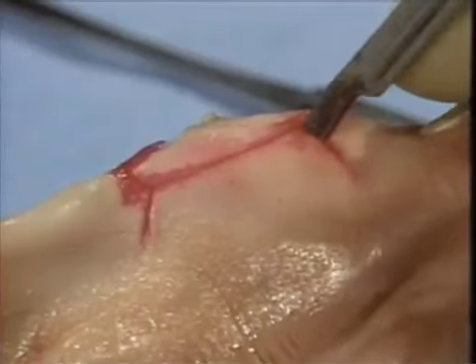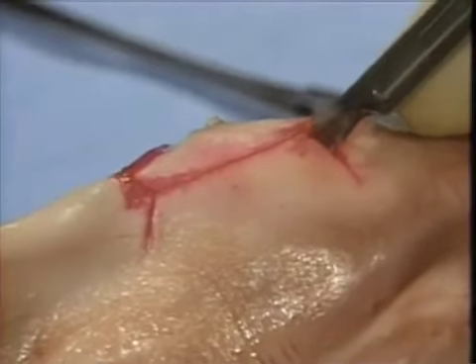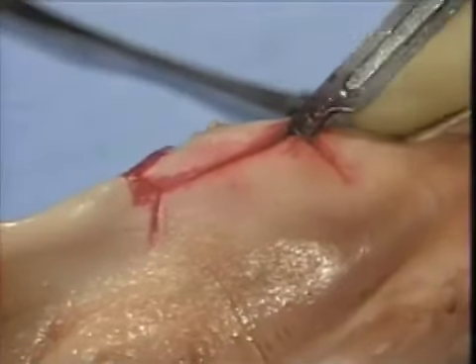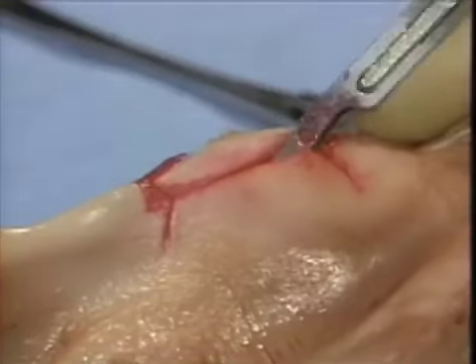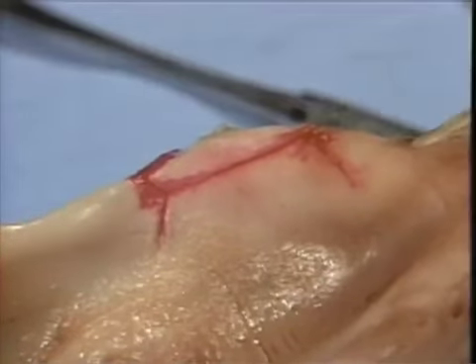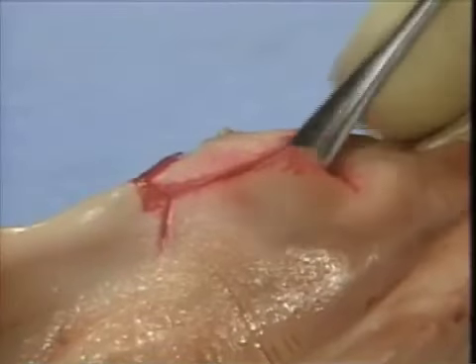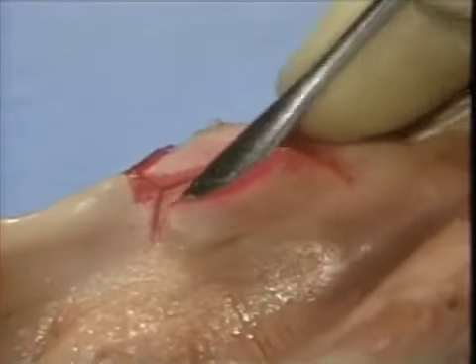Initial elevation of the flap should include sharp dissection beneath the periosteum using the scalpel both as a knife and as a periosteal elevator. Once the periosteum is totally incised and the flap is slightly movable, a periosteal elevator can be applied with gentle pressure under the periosteum to elevate the flap.